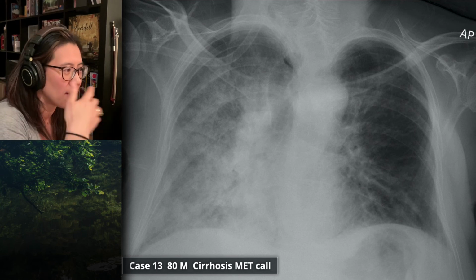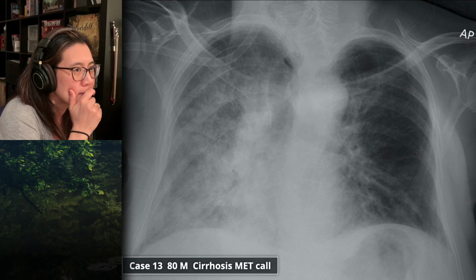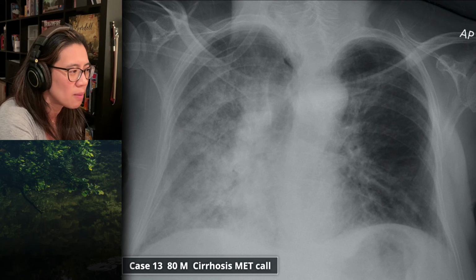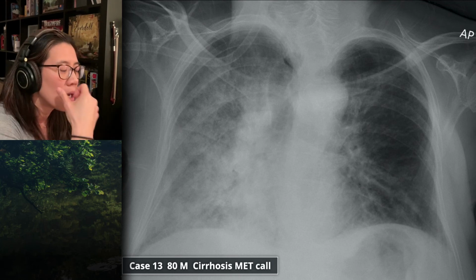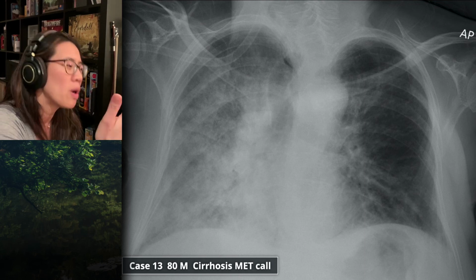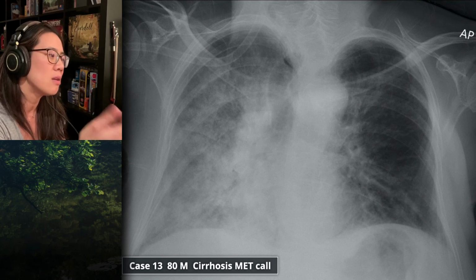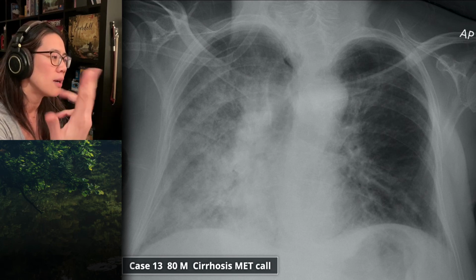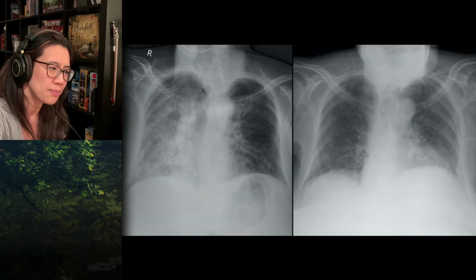In the acute setting, if it was a chronic process, then the differential is quite different. No, he's acutely unwell. Yeah. So my gut feeling is that this is probably pulmonary edema with the patient nursed on one side down. Differentials would include pneumonia with an associated left ventricular failure, or another process of unilateral pulmonary airspace opacity. So pneumonia, hemorrhage, pulmonary edema, as I've described. Good. Next image.